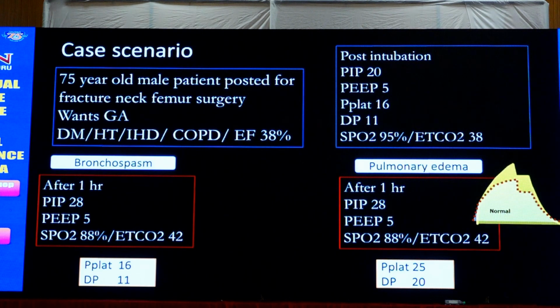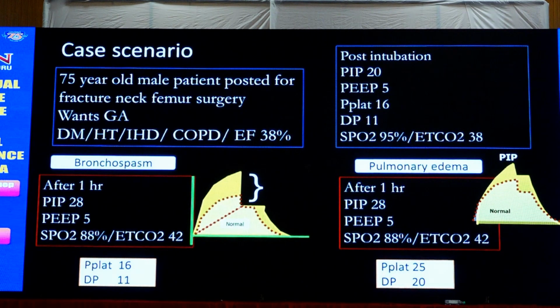Right. So there is no problem either way, because every anesthetist, when there is a saturation problem, gives a cocktail. Lasix, steroid and a bronchodilator. So it has covered everything, no? There's a common cocktail in the ICU also. But that's not the way you do, because I have taught you to differentiate between bronchospasm and an alveolar problem. Airway problem and alveolar problem. But obviously, if somebody in a laparoscopy has a situation like that, then you should account it for a chest wall problem. And you should increase the PEEP. Thank you.